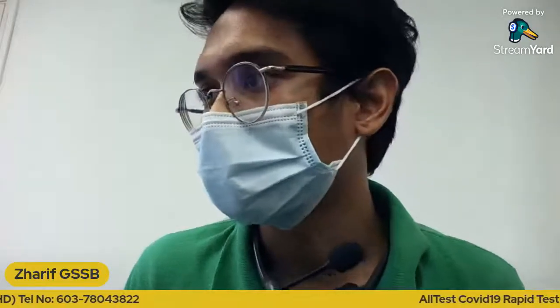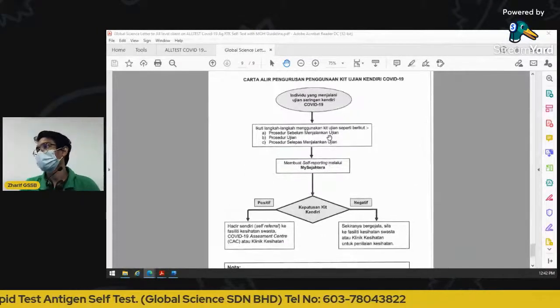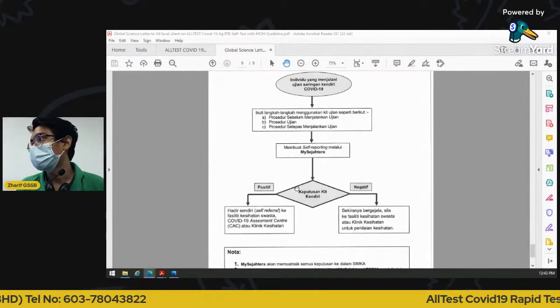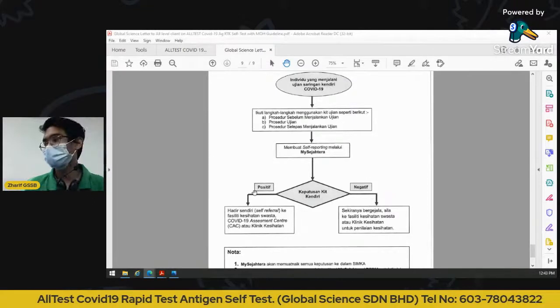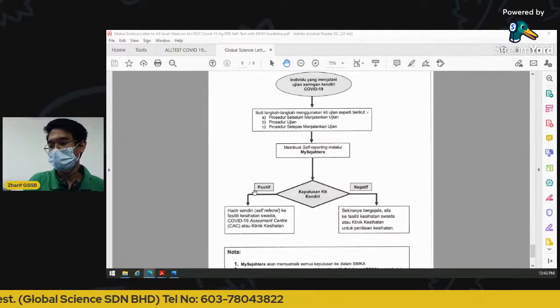Okay, once you've interpreted your results, there is a guideline by MOH, which is the Ministry of Health from Malaysia, and this is the guideline. So as you can see, once you're done with the self test and your results appear to be positive, what you need to do is self-report on MySejahtera. So for those who don't know, I will show you how.